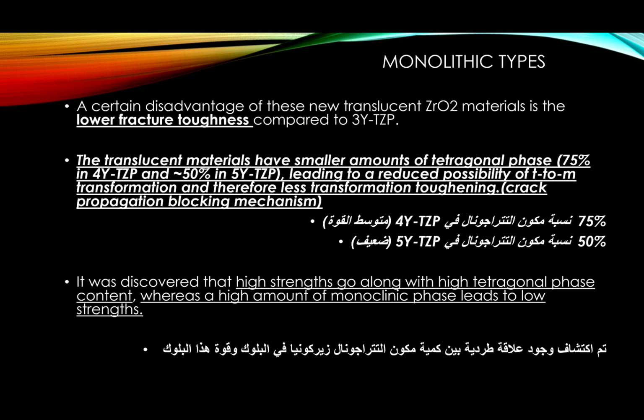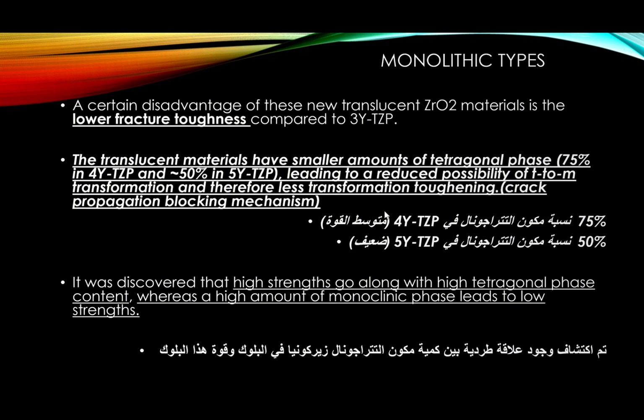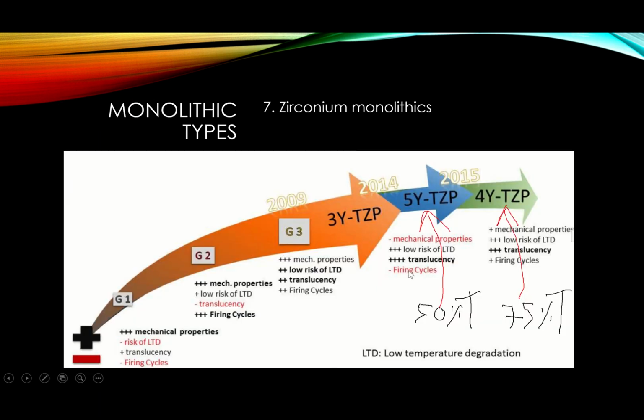It's a kind of crack propagation blocking mechanism as well. We will discuss that in detail as well. But for now, I want to lead you to this illustration again. We looked at that. We said that these are the generations of the zirconia.